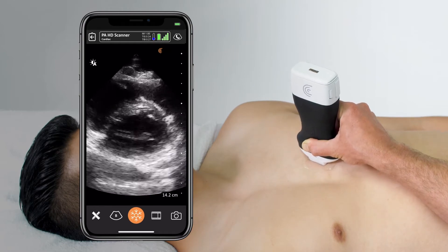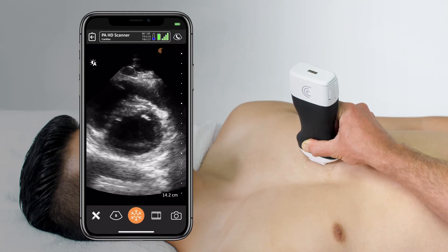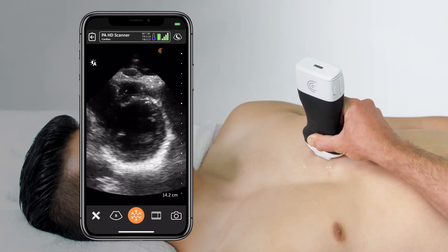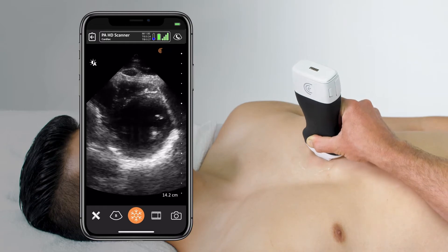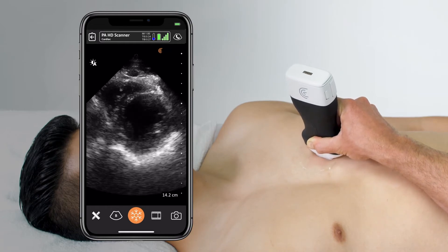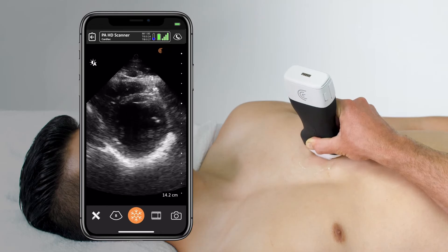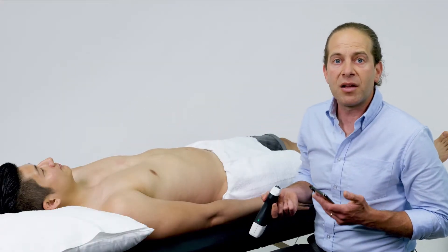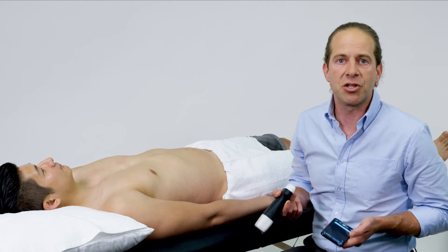You can see here the mitral valve is right at the window in the middle of the ventricle, and so to get it at the ideal mid-ventricular view, I'm going to slowly slide the transducer towards the ventricle until I have a nice, round, symmetrically squeezing left ventricle. Once I've scanned through the long and the short axis, I can feel confident in assessing the various features of his cardiac function.